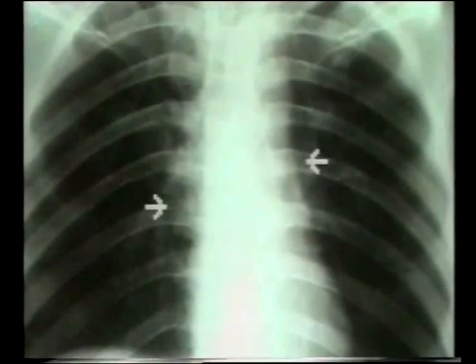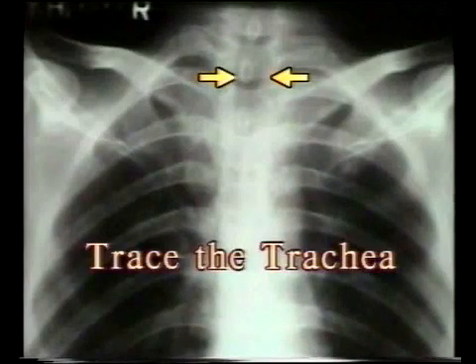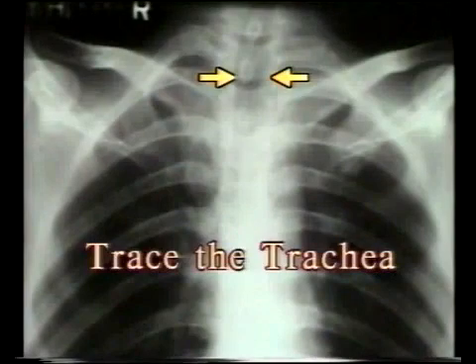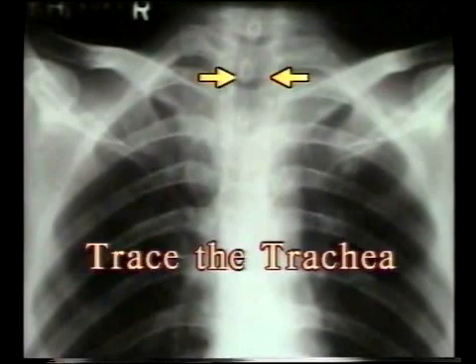Then study the hila, represented by the shadows of the hilar vessels. The left hilum is normally at a slightly higher level than the right. Lastly, identify the course of the trachea up to the carina for any deviation. This completes the inspection of the lung fields.